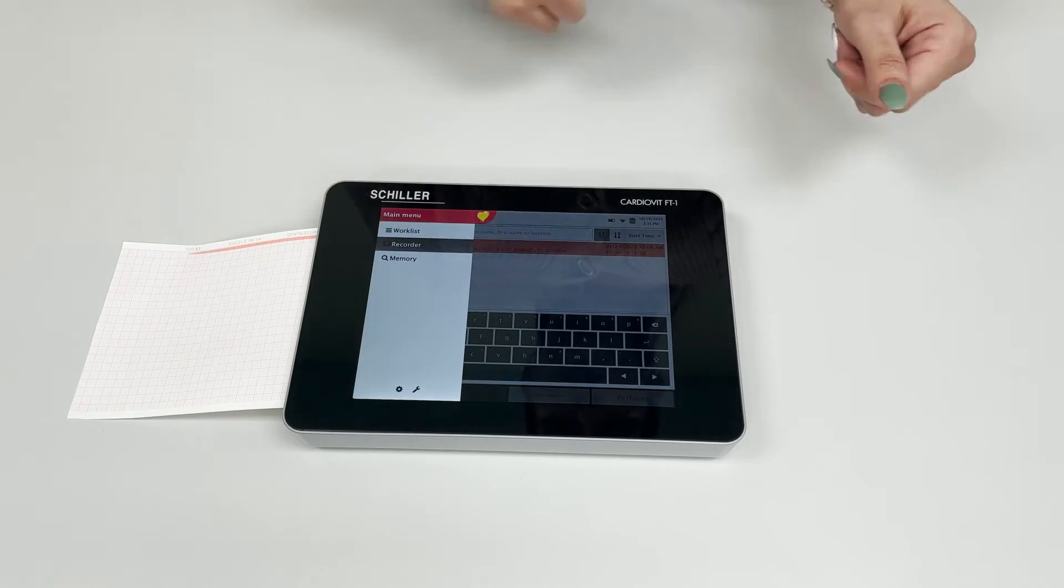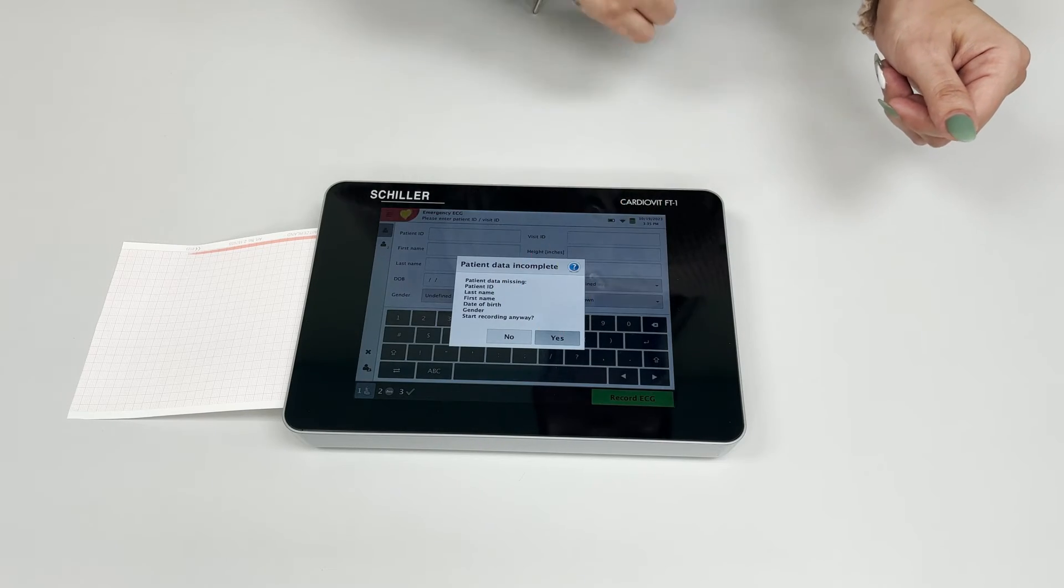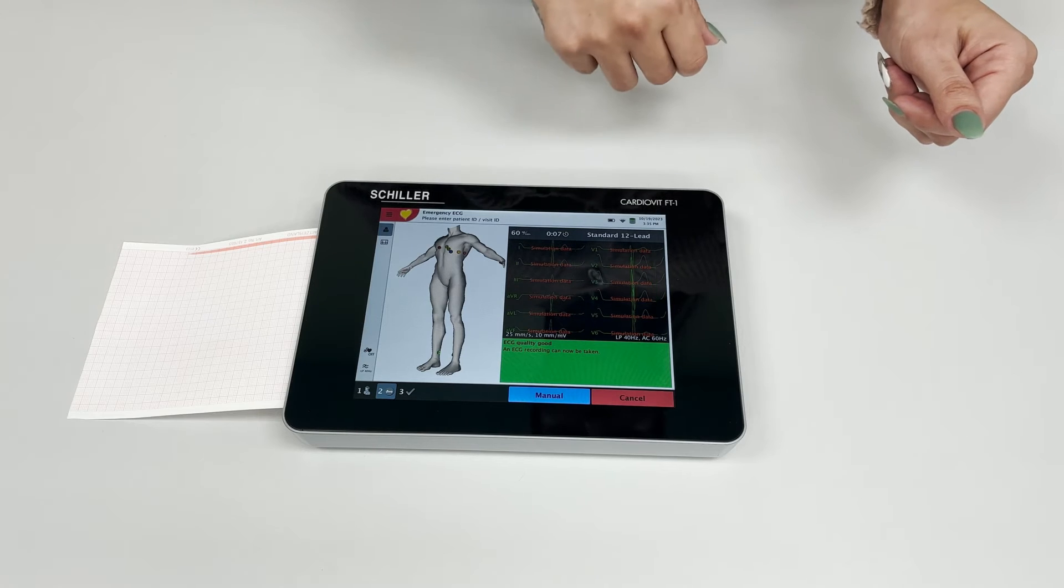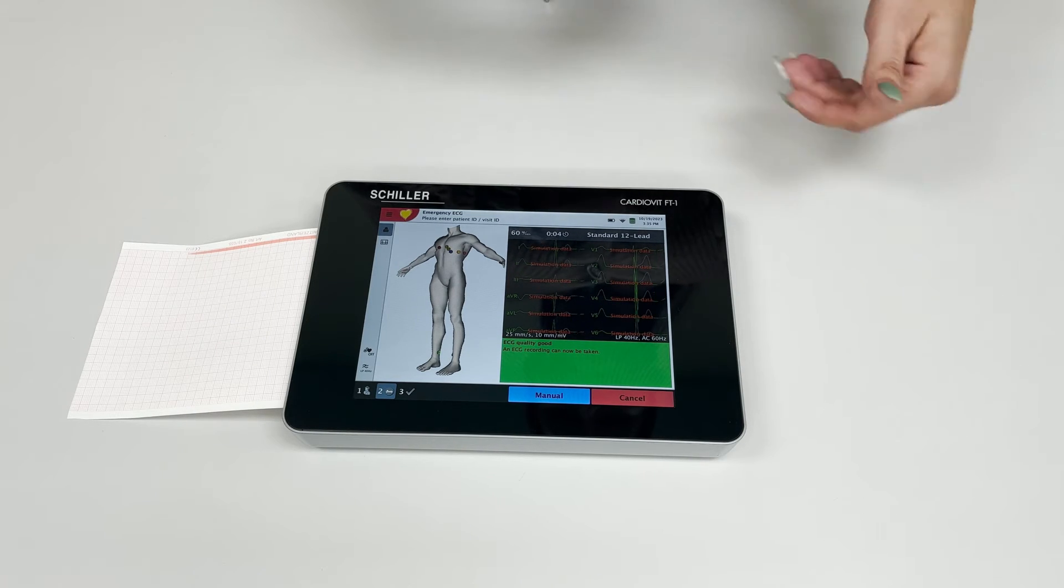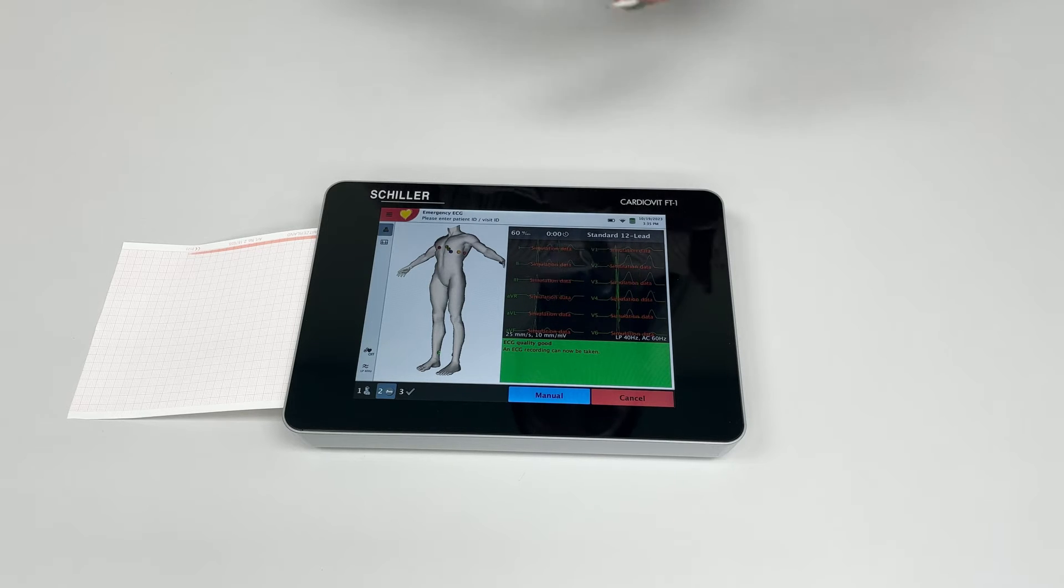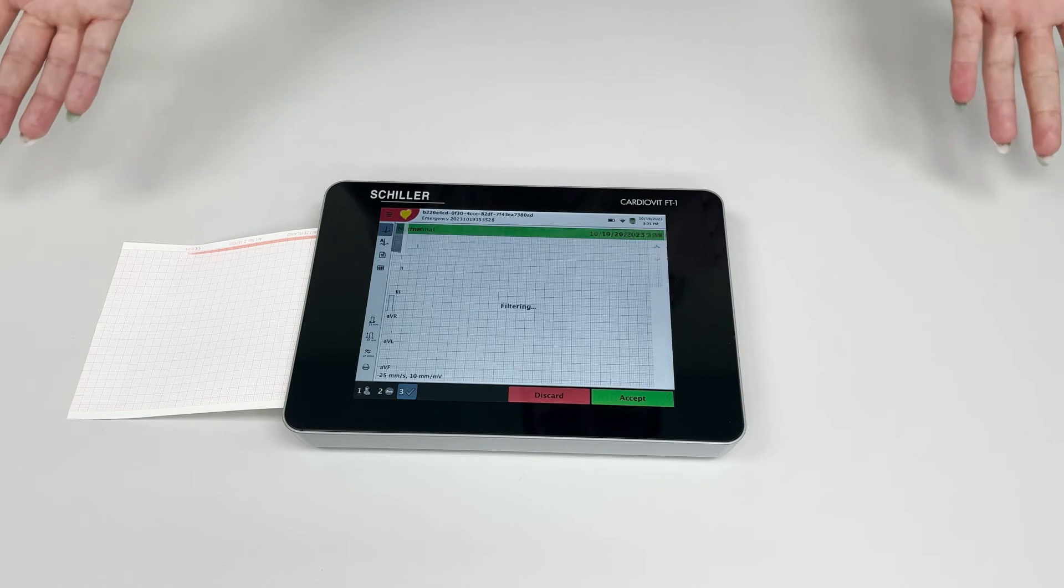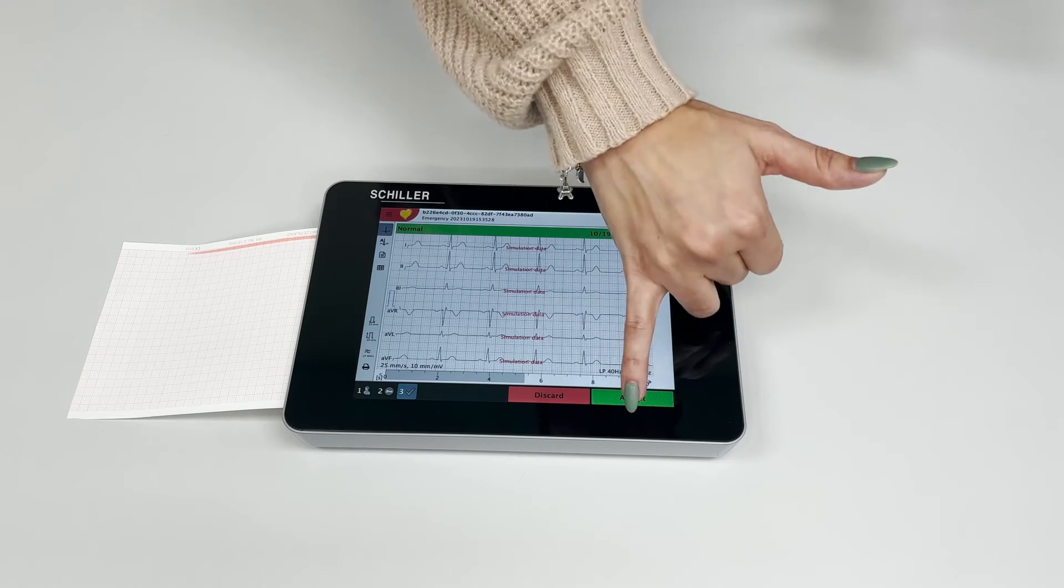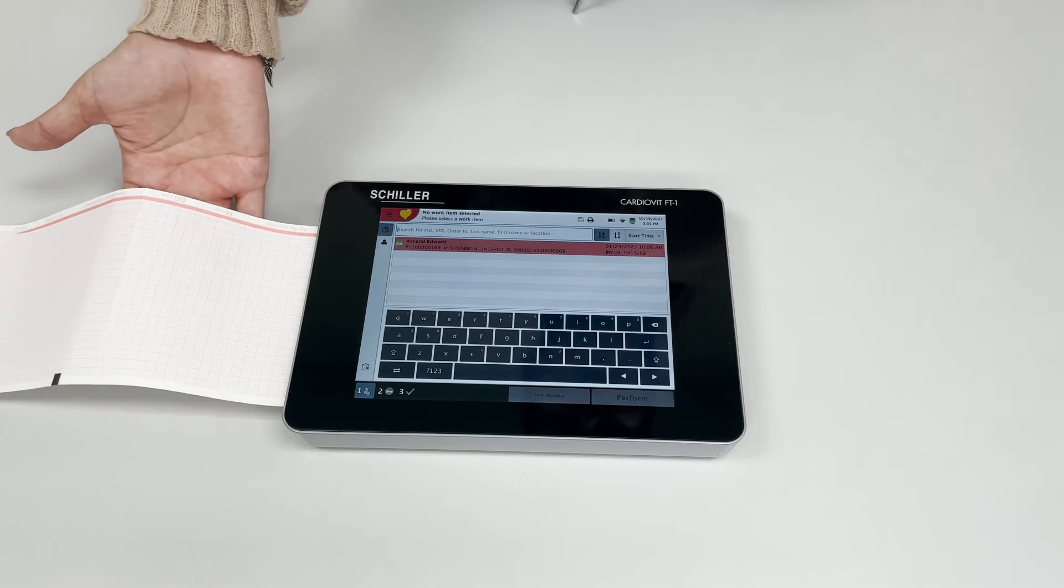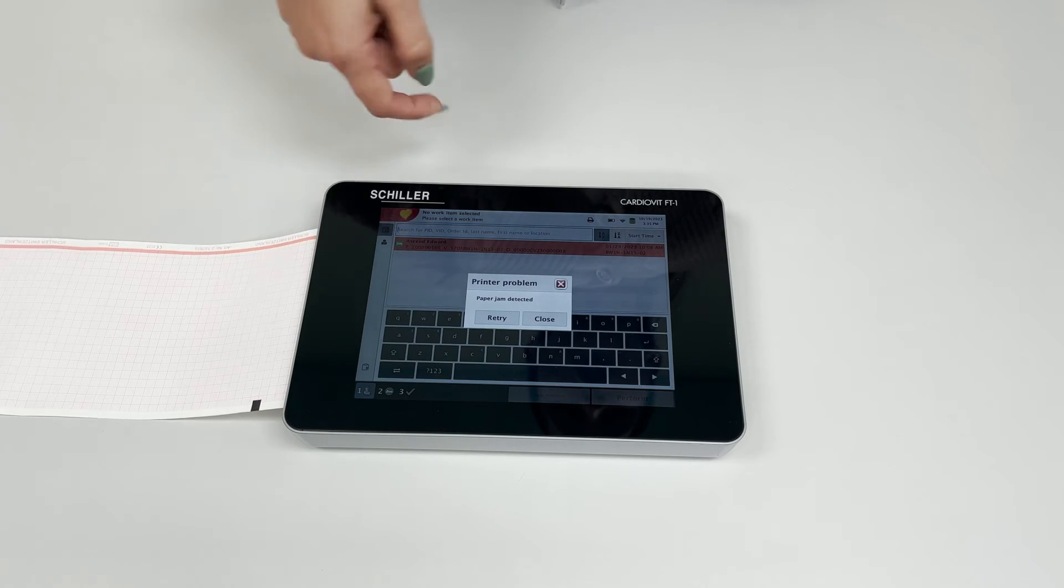Let's do a recording once again. Once you press accept, you'll notice there's nothing being printed on the paper. The unit will give you a paper issue message.